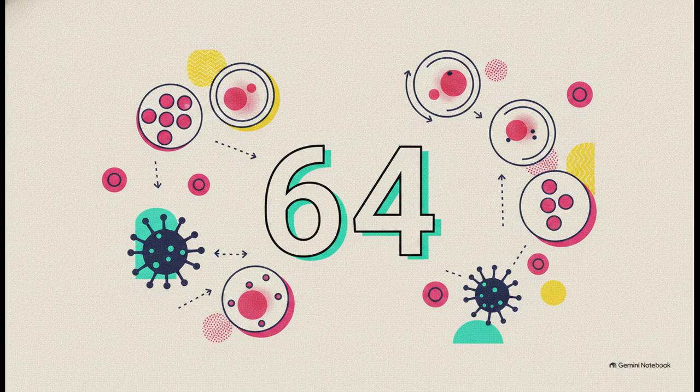When standardizing this HA antigen, scientists need to find its HA titer. This is the measure of its hemagglutinating activity. Basically, they're looking for the highest dilution of the antigen that still produces that diffuse mat we just talked about. Let's say the last positive dilution was 1:64. The HA titer is simply the reciprocal of that number, so flip it, and your titer is 64 HA units. This specific number proves the exact activity level of the antigen preparation before it ever hits a diagnostic clinic.